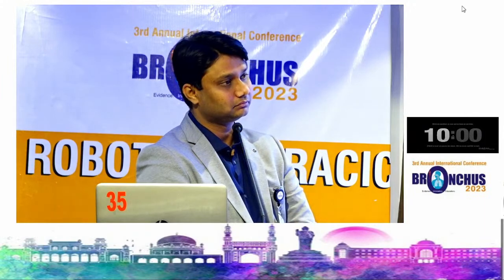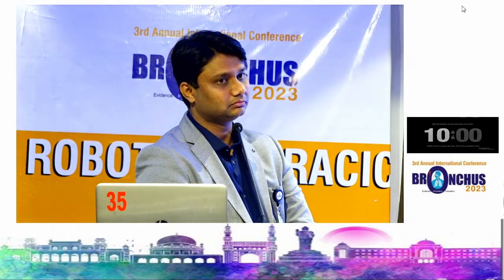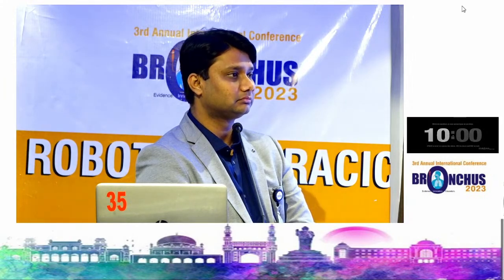Second, when we look at the left upper lobectomy, conventional teaching is that you first take control of the pulmonary artery, identify the arteries to the lingula, and start dividing the arteries, then get the lobe above, then do the pulmonary vein, and then the bronchus. But we have seen that the vein was clamped first, then the bronchus, and then we were doing the arteries. Is it that you follow what is convenient, or do you follow the traditional teaching methods?